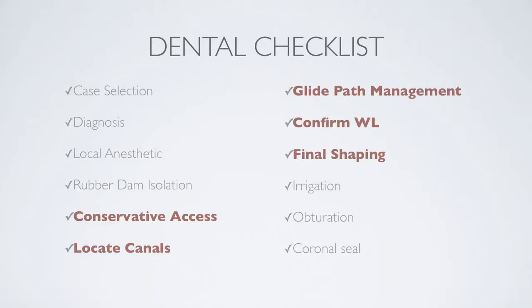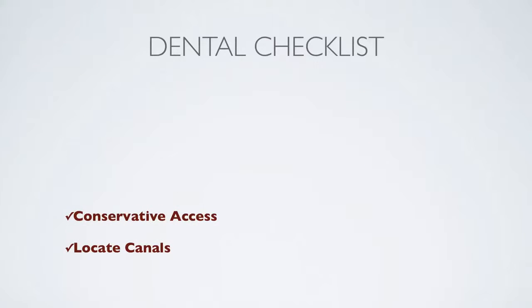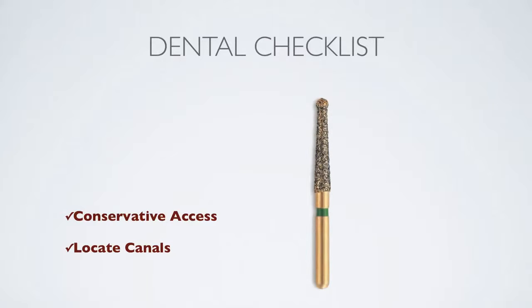Let's take on the first two highlighted items: conservative access and locating the canal. Now that we have the rubber dam in place it's time to perform a conservative access preparation. I always start with a lexicon endo access burr, which allows for ease of penetration into the pulp chamber. I enlarge the access with the endoz burr shown here — I like this burr since it's non-end cutting and has a slight taper, which will result in ideal cavity prep when finished.